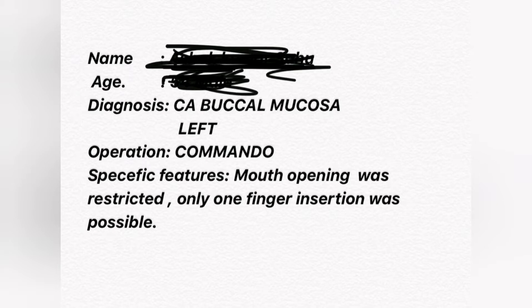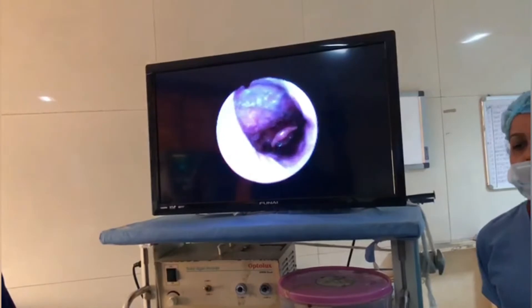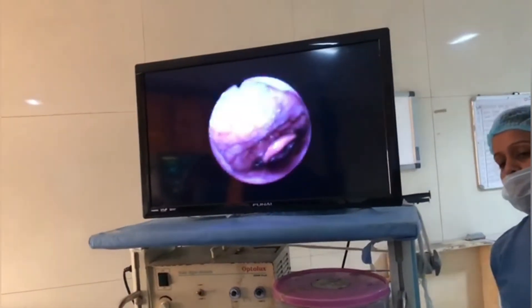Nasal preparation of the patient included otrivine nasal drops and xylocaine jelly. The bronchoscope is introduced through the nose of the patient, and the patient is kept awake throughout the procedure.